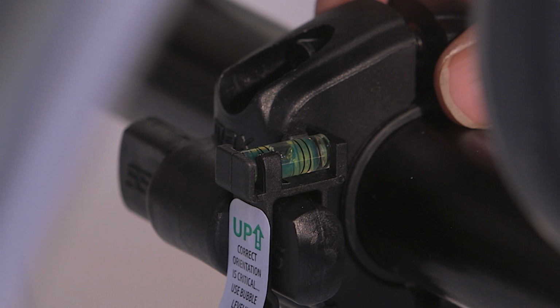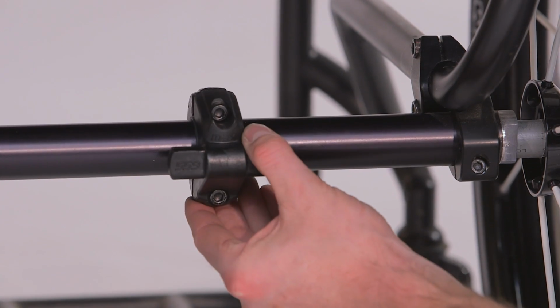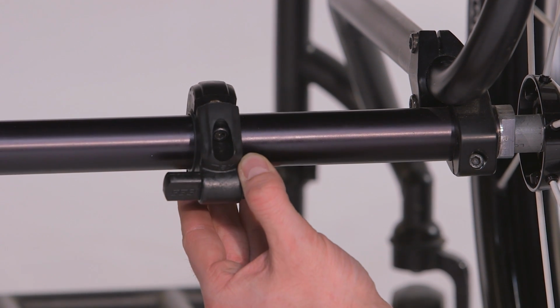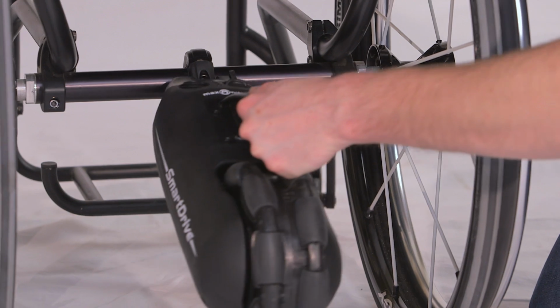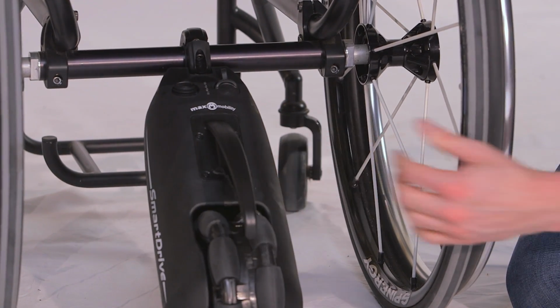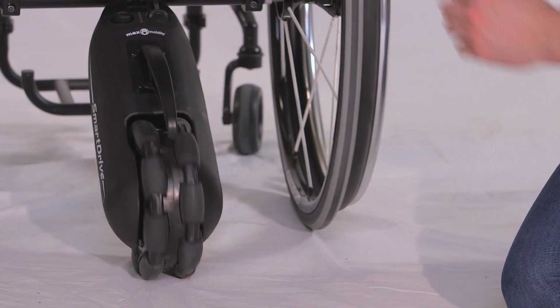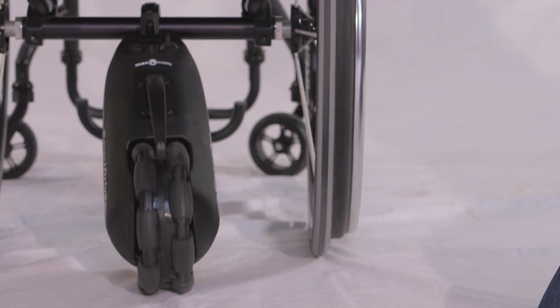If the clamp isn't perpendicular, then that can create some problems. When the clamp is installed or rotates down, it doesn't allow for the drive unit to completely engage its extrusions. In this circumstance, you will see the drive unit waddles behind the chair, which can make it unnecessarily loud. You also run the risk of the drive unit coming completely off the chair, which is never good.